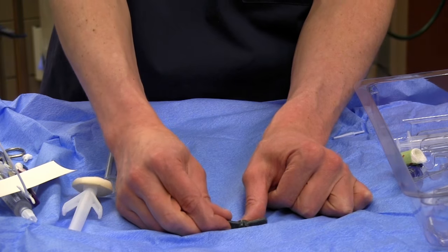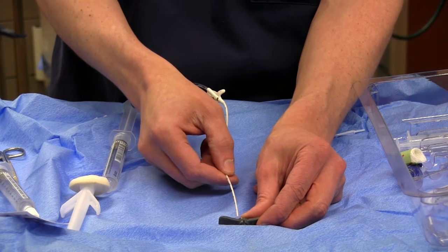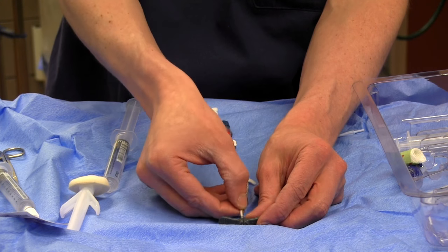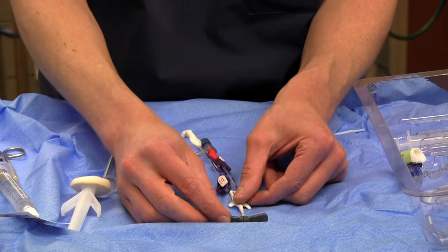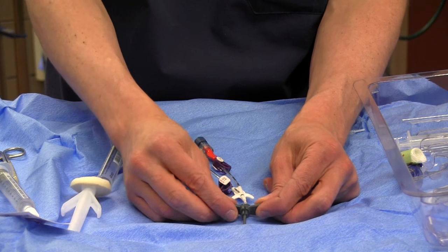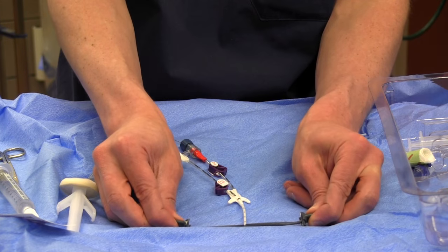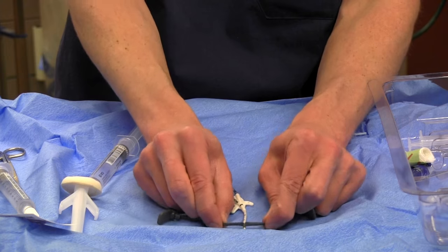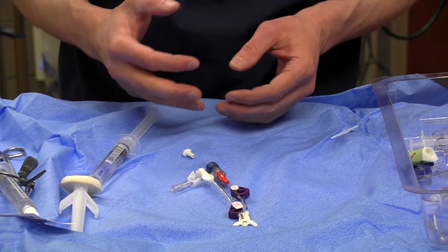Now you have the dilator in the vessel if you want to check — blood, blood, blood, okay, that's good. Now you're going to take your midline, making sure the wire is not protruding, and advance it right into the vessel. Stop when that much of the midline is still out because now you're going to break this dilator. Pull out a little bit from the skin, crack it, pull until it reaches the skin, then pull more out, separate, pull more out, separate, pull more out until it's totally broken outside the skin. Then you can pop your midline all the way in. Make sure you get blood return from both ports — done.